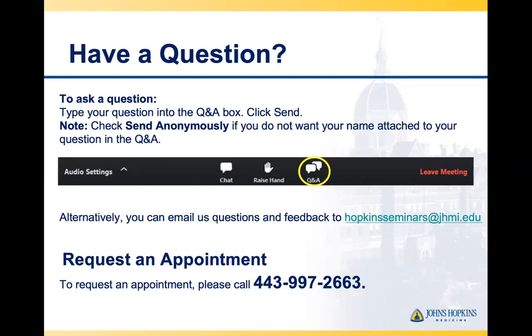A dual mobility implant is one that's used in total hips in which there is a small ball that fits into a large ball that fits into an even larger ball that fits into the socket. So it has two modes of articulation or two places where the ball goes into a socket. And for it to fail requires usually a failure at one of those or both of those. When you have an intraprosthetic dislocation or dissociation, meaning that the smallest ball typically comes out of one of the other balls that make up the dual mobility implant.